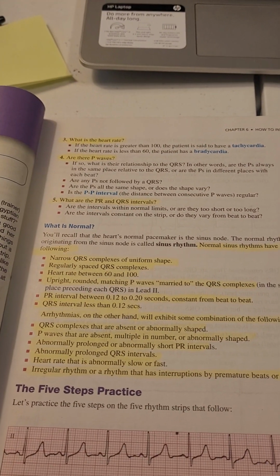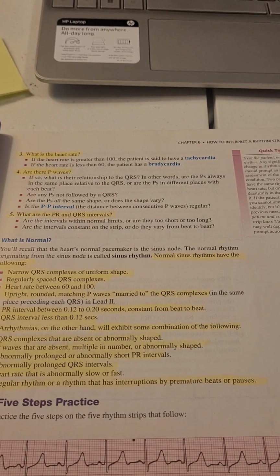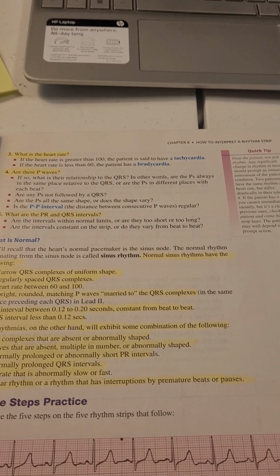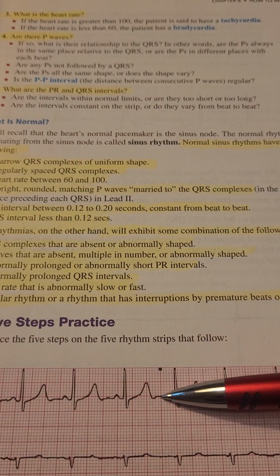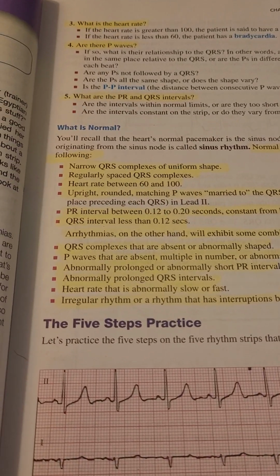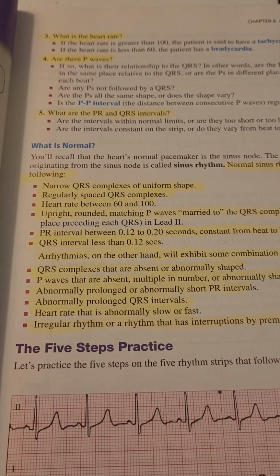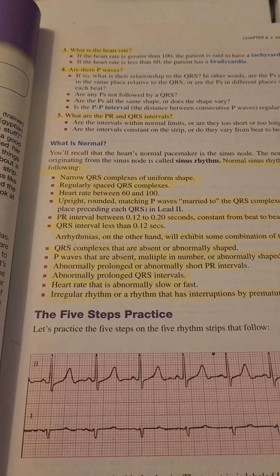Or abnormally shaped P waves. Abnormally prolonged or abnormally short PR interval. If the P wave is too far back or too forward, there's a name for that rhythm. I'm just saying that's abnormal, so it has a name.